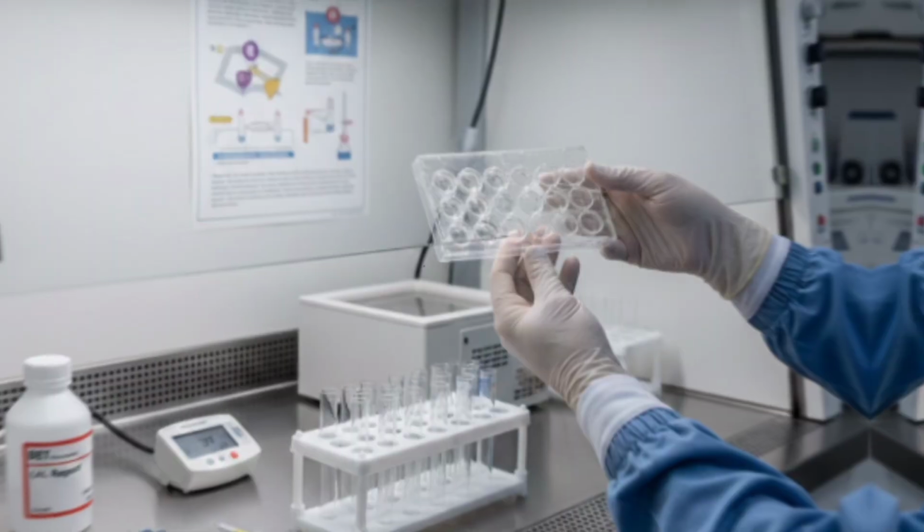Labeled lysate sensitivity test is a verification step used to confirm that the lysate reagent performs at the exact sensitivity stated on its COA. The value of lysate sensitivity is called lambda.